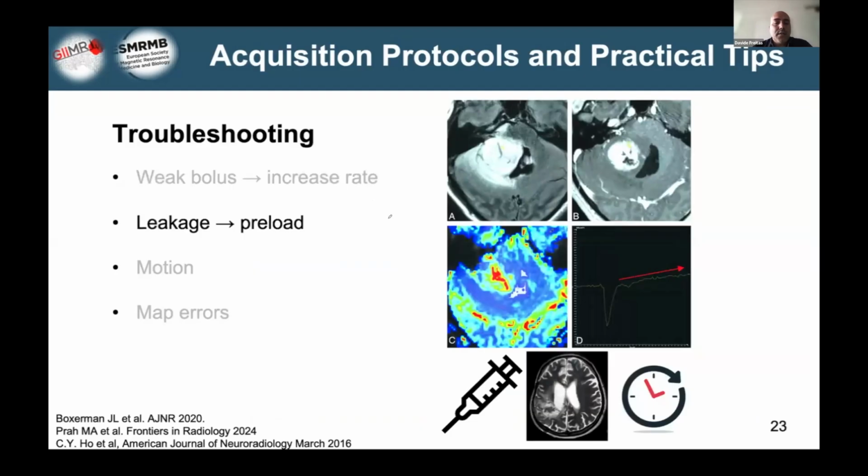For glioma indications, always use a preload strategy due to the potential breakdown of the blood-brain barrier. It is typically performed before the T2 sequence in order to save time within the protocol and use the same injection rate as the main bolus, essentially as a test run to ensure optimal bolus delivery.